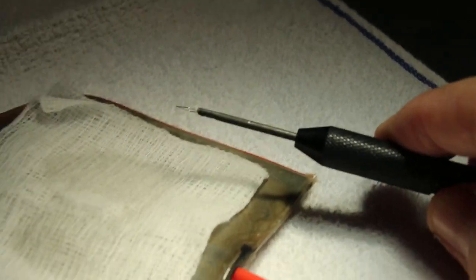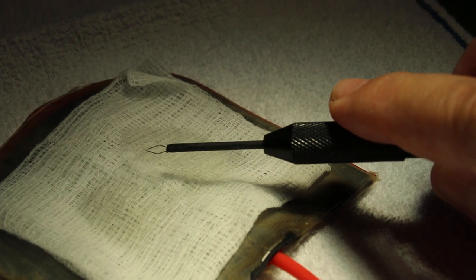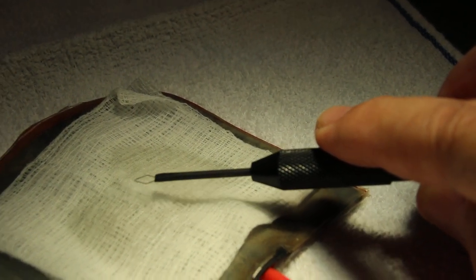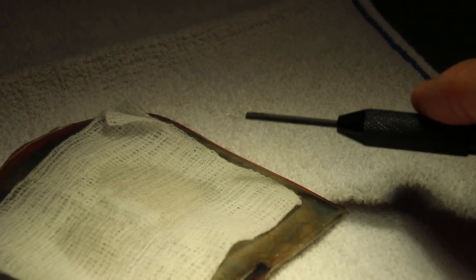So that is the electrosurgery. Hamster will be put on this pad. Electricity will go in, and then I will just put this into the wart and switch on and cut it off. There should be no bleeding because of electrosurgical cutting.